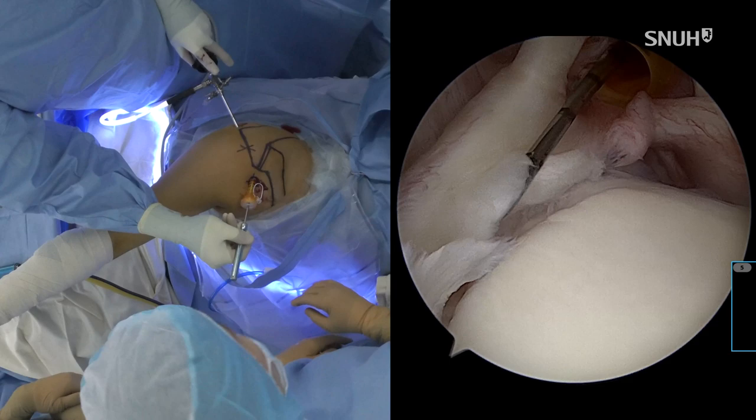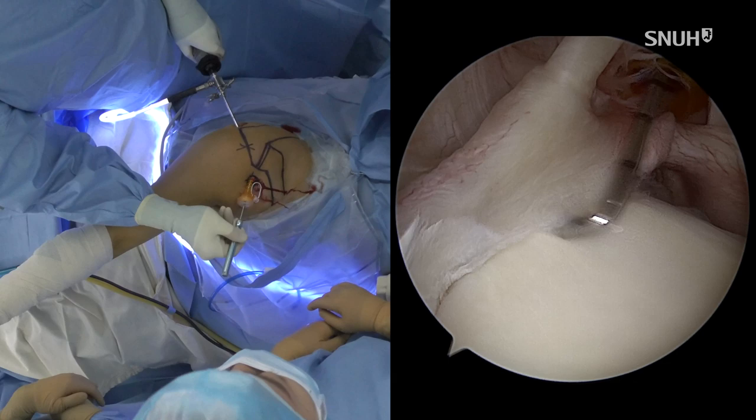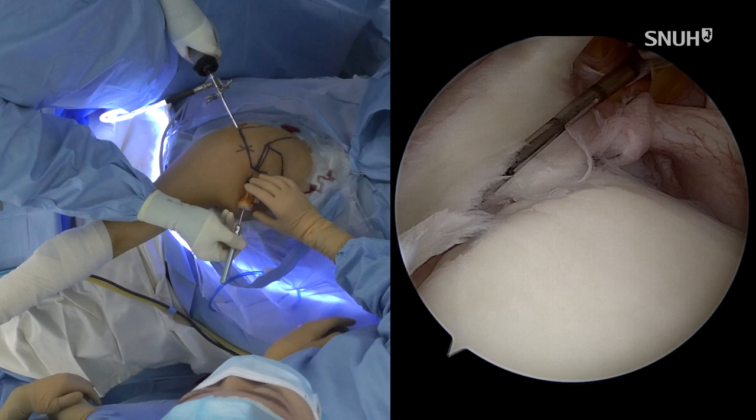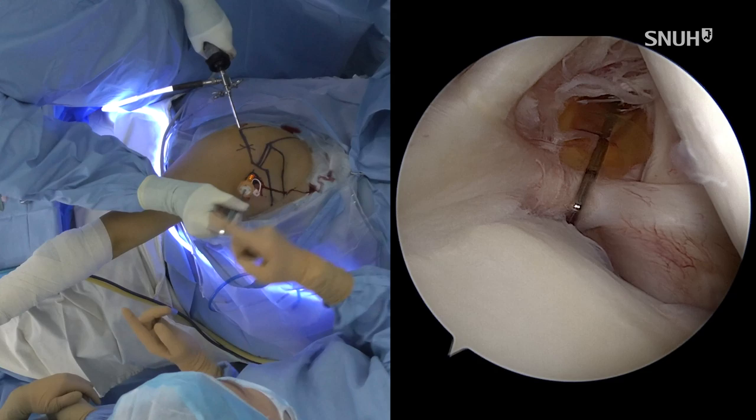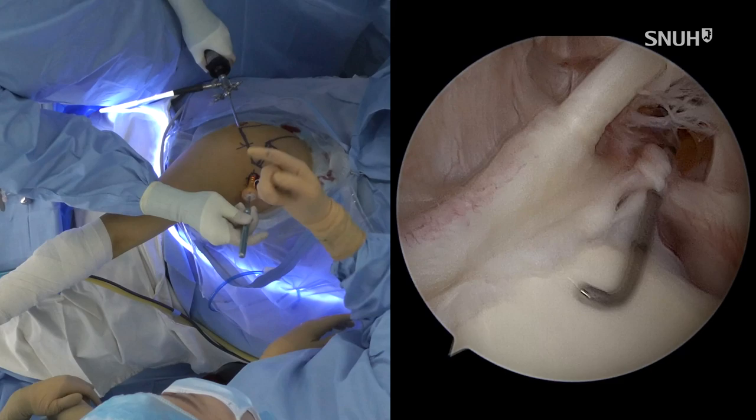The arthroscopic diagnostic clues for the SLAP are a separation of more than 5 millimeters, a cartilage crack like this, and some kind of inflammatory granulation tissue around here. That's the clue for a true SLAP lesion. And actually, this is SLAP 7. The SLAP lesion is connected to the MGHL. That's probably the SLAP type 7.